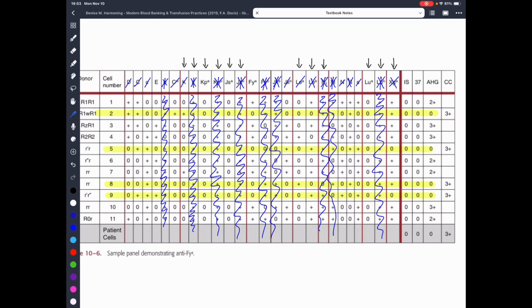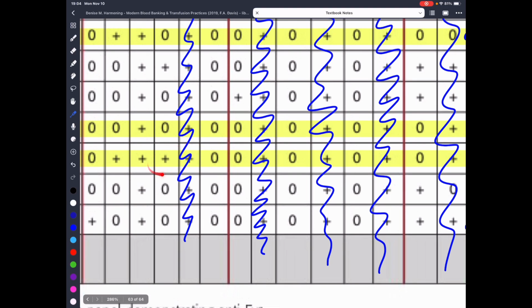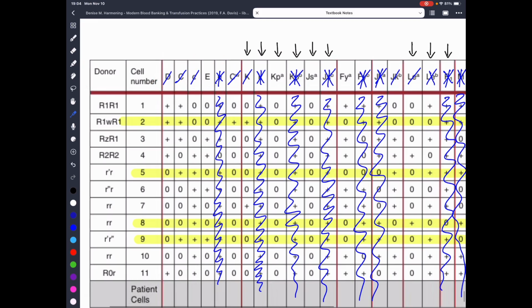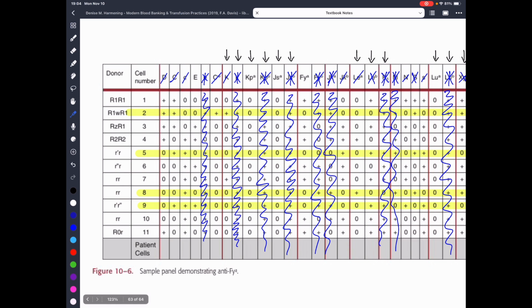Here we have 0, plus, 0, 0. This is the opposite situation. We have capital E antigen present, but there's no agglutination, meaning there are likely no antibodies that bound to the E antigen. But if it's homozygous, which it is here, heterozygous, sorry, there are 2 pluses, so it's heterozygous, and these are the ones that must display homozygous genotypes in order for us to cross it out.